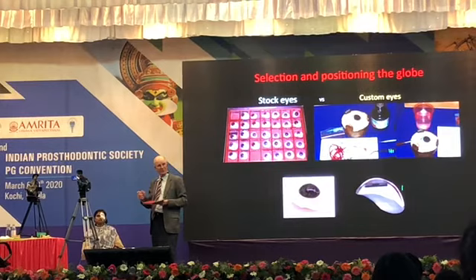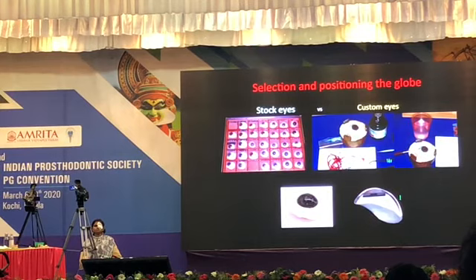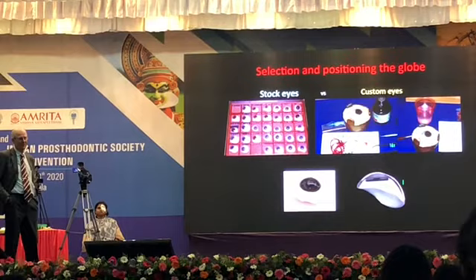So sometimes you have to custom make them in order to have a globe of the right spherical dimension. All these little things go into making a successful prosthesis. It's not the easiest thing to do.